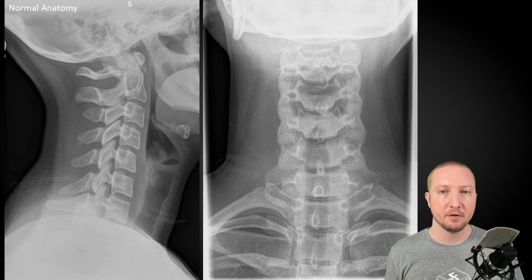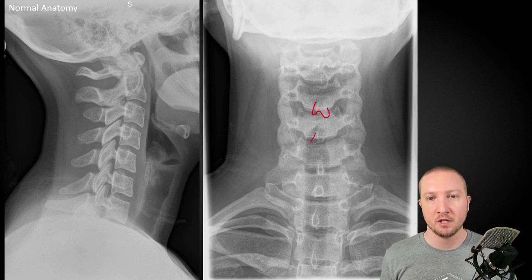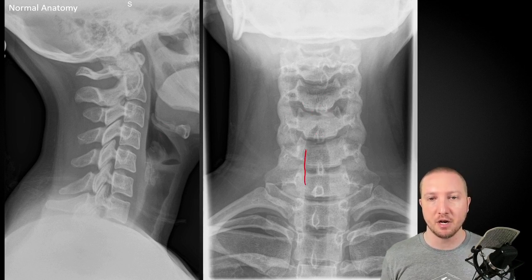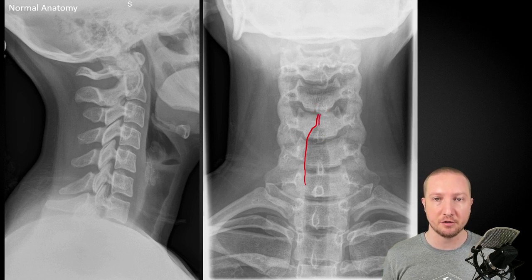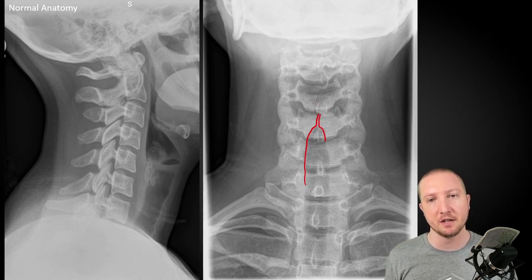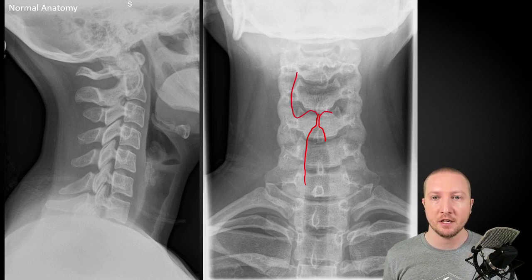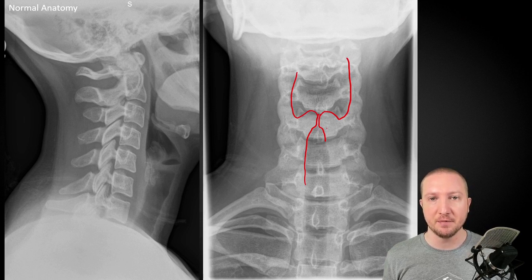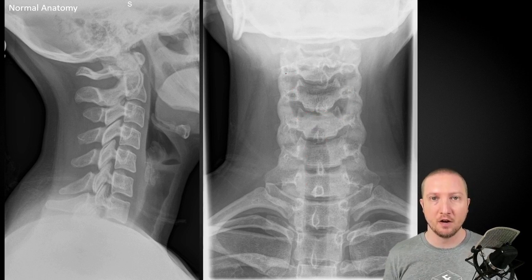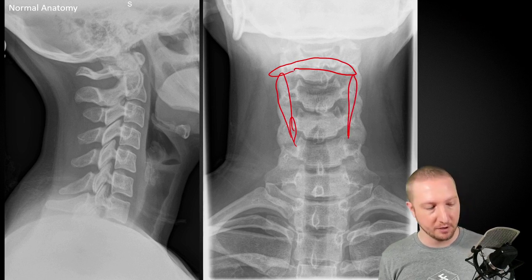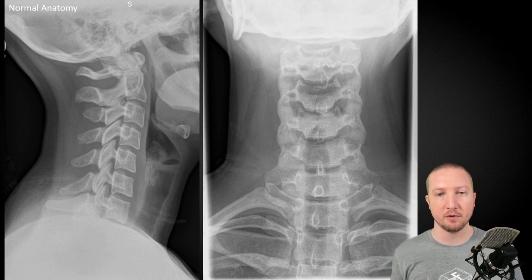On the frontal radiograph, we can see the bifid spinous processes in many cases as well. When looking at the air shadow, the tracheal air shadow comes up and narrows at the laryngeal constriction, which sometimes appears as a vertical lucent line on the frontal radiograph. That's a normal finding, but sometimes people mistake it for spina bifida occulta. Above that we have the piriform recesses, and the hyoid bone often projects transversely and may align with the tracheal cartilage, creating an almost ring-like shape of calcium — just not to be mistaken for abnormal anatomy.